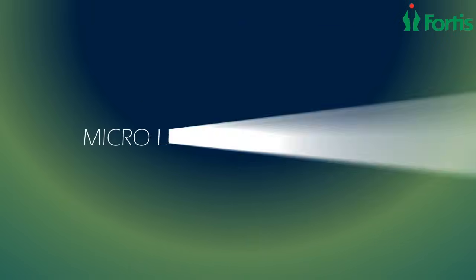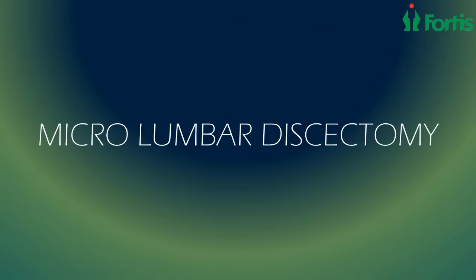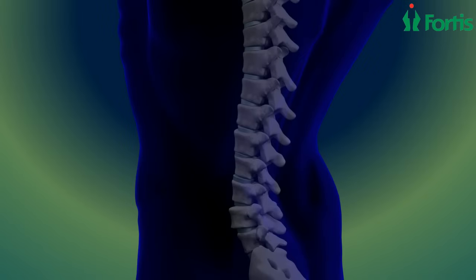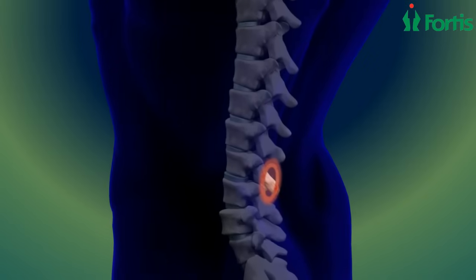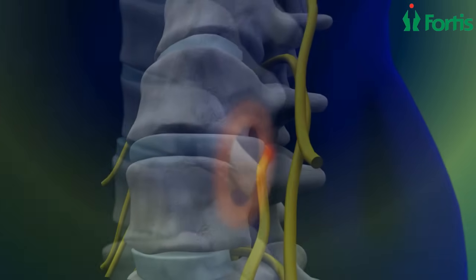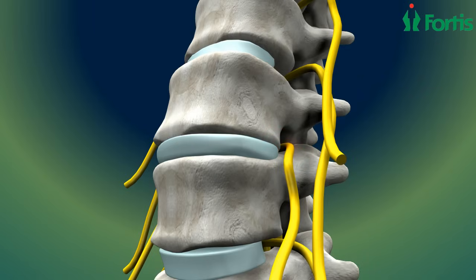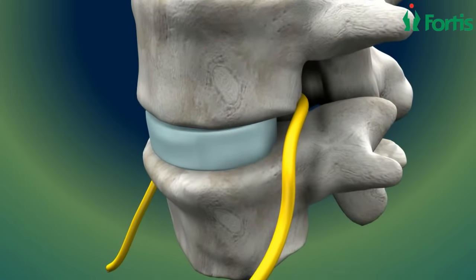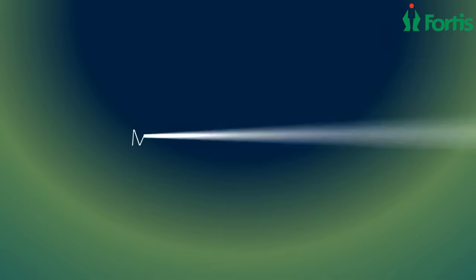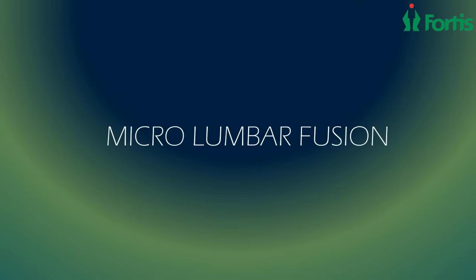The surgical treatment of herniated disc in the lumbar region is called micro lumbar discectomy. In this process, the surgeon makes an incision over the center of the back and uses the interlaminar space to access the prolapsed disc microscopically and relieve the spinal nerve compression. Once removed, the spinal nerve gets decompressed into its normal state, giving relief to the patient.